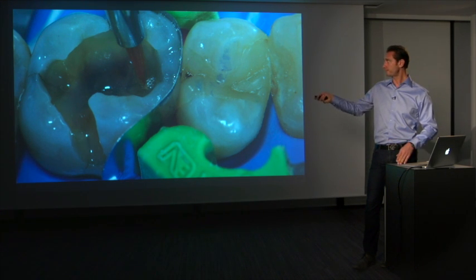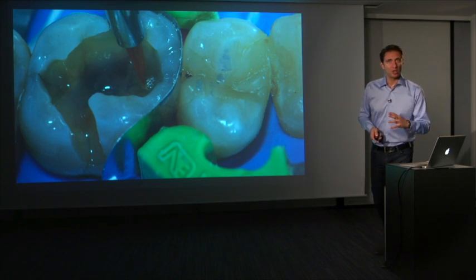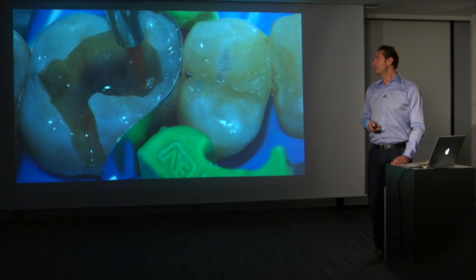This allows us to create something anatomically shaped already, without too much need for corrections.